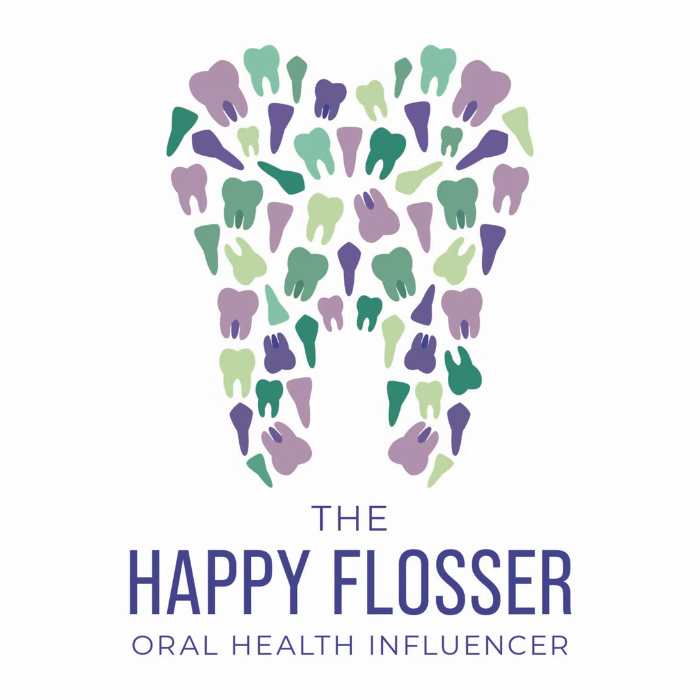So the horizontal contour shows us the crest of the adjacent teeth being at the same level. And when we have horizontal bone loss, which is the most common component of bone loss, the surface of the interdental crestal bone that's covered by a thin layer of cortical bone will be lower than about 2 millimeters apical to the CEJ, but it will still be parallel in its consistency.